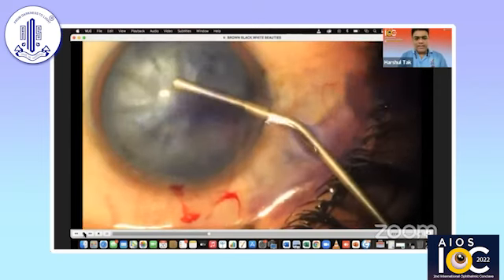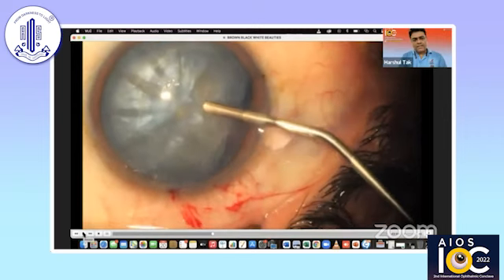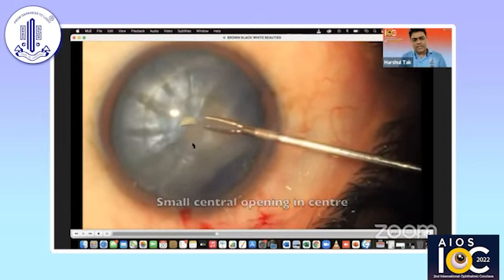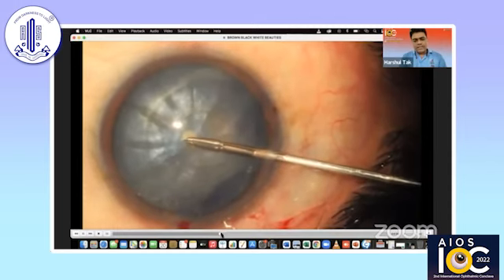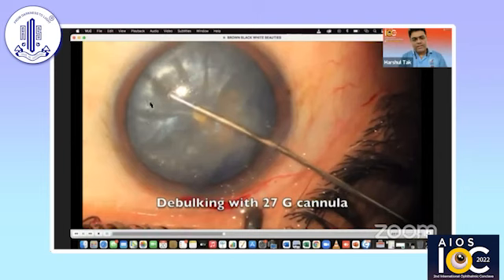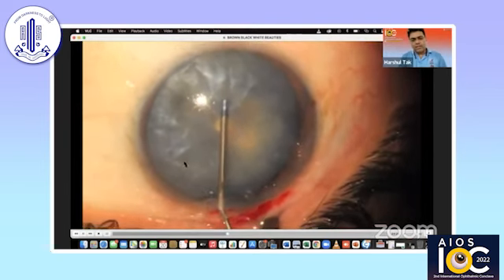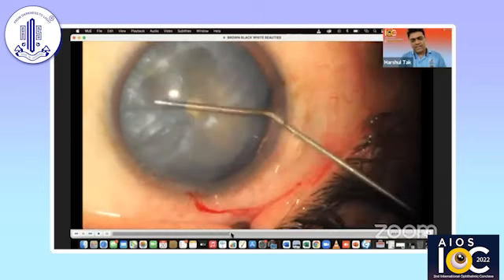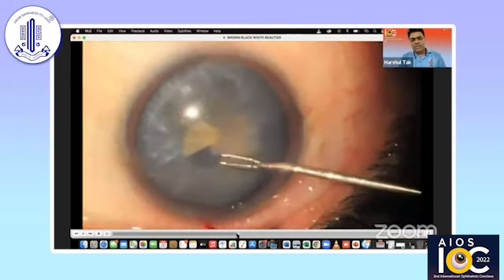Coming to white cataracts, we all know that there is a liquefied cortical matter in the capsular bag, and the trickiest part is to create a safe capsulorrhexis in these cataracts. The technique I use is a sequential two-stage capsulorrhexis. I make a very small opening in the center because this is the safest area to create the rhexis. Once I create this small rhexis, I use a 27-gauge cannula mounted on a 2cc syringe, and you can see the mid-peripheral liquefied cortical matter being sucked out. Once you aspirate this from one side, I go from the second side port and the capsular bag gets debulked. Then you can create a definitive capsulorrhexis of the desired size. It's important that you debulk the capsular bag nicely and then use micro scissors to give a tangential cut in the capsular margin.